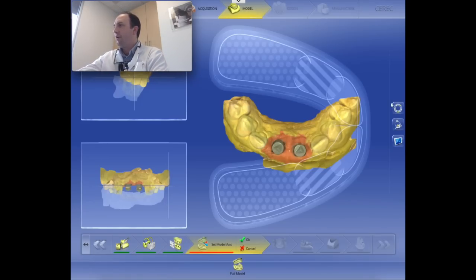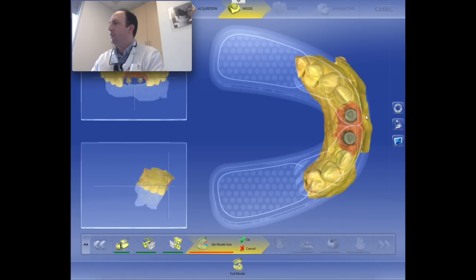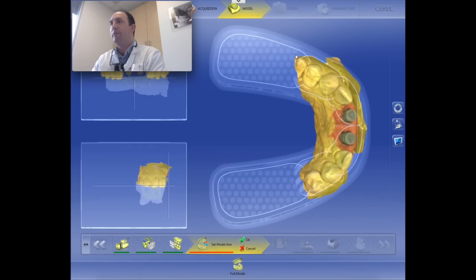Okay, let's get to the design process. I hope you don't mind I'm looking this direction so I can see the CEREC screen a little bit better. So here's what we're doing. First step is to go ahead and position these where they should reflect the position of what the mouth is in. Ideally line these up. I like to put the incisal edge right along this line here just to make sure that it reflects the actual position in the mouth. You can see I have really clear images. Let me move this plane up just a smidge.